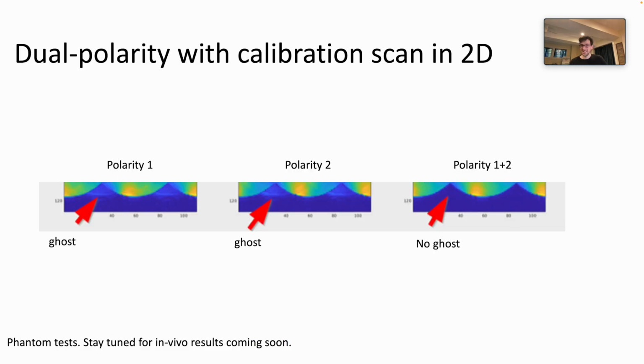While we tested this dual polarity approach mostly on 3D EPI with alternating TRs, it does show similarly promising results when using a single image reverse polarity calibration, here visible as reduced ghost levels, as implemented in the 2D CMRR multiband sequence.